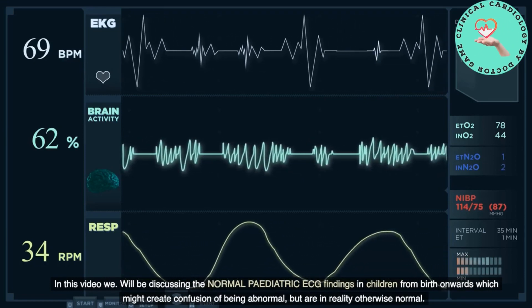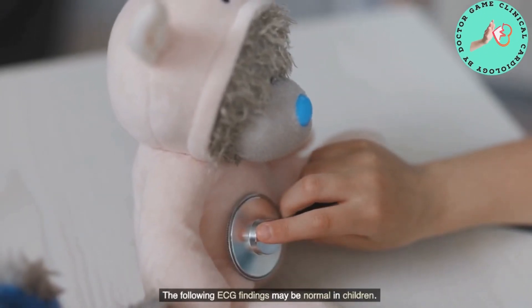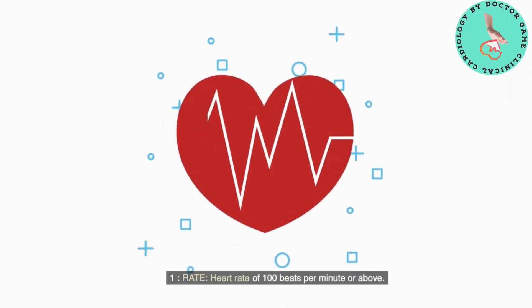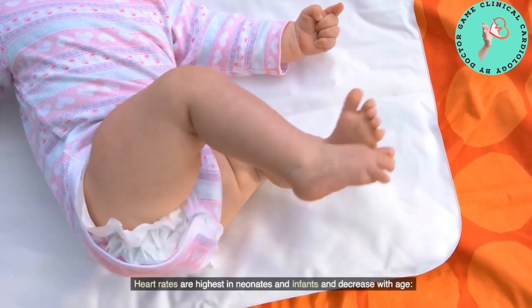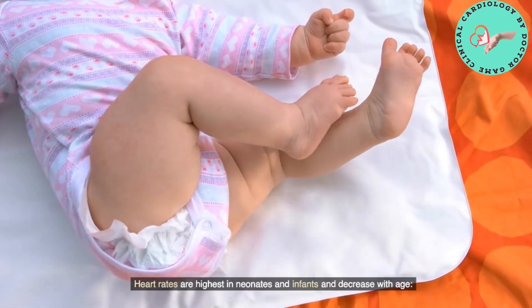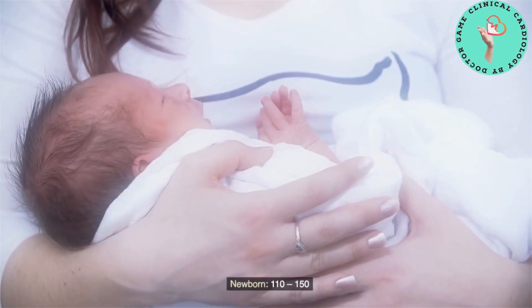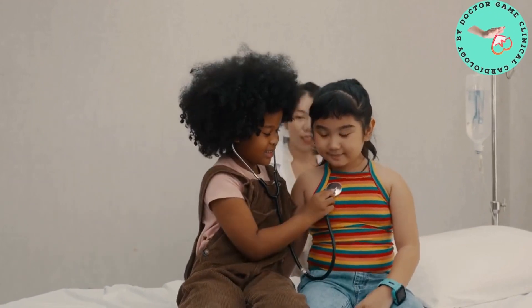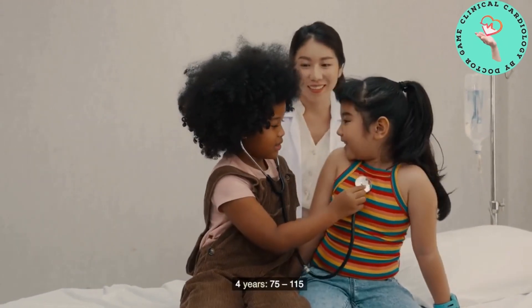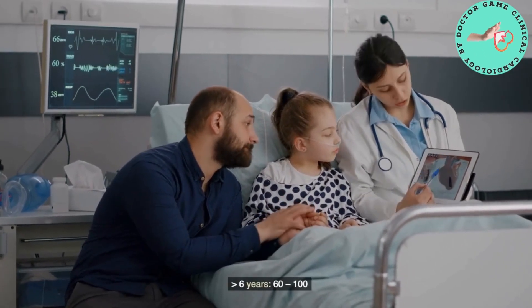The following ECG findings may be normal in children. One: heart rate of 100 beats per minute or above. Heart rates are highest in neonates and infants and decrease with age — newborn: 110–150; two years: 85–125; four years: 75–115; greater than six years: 60–100.